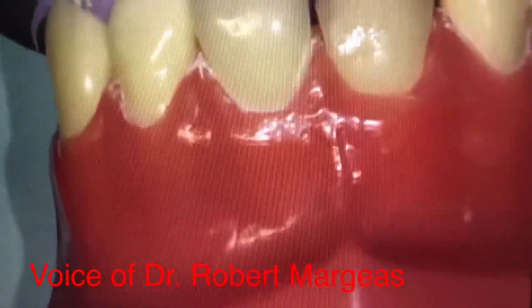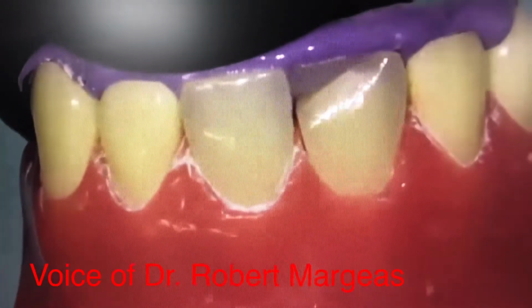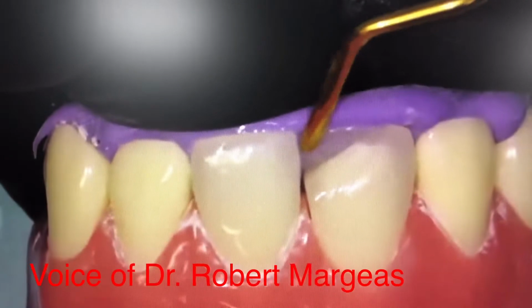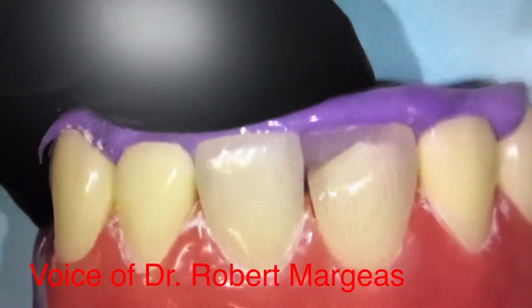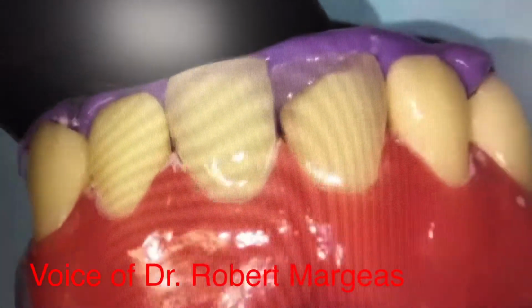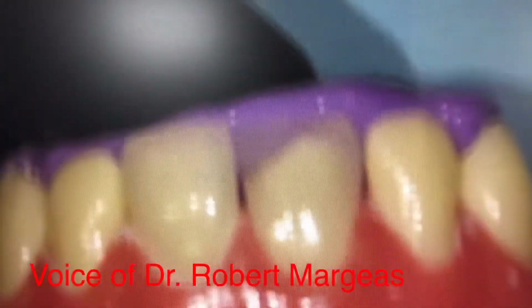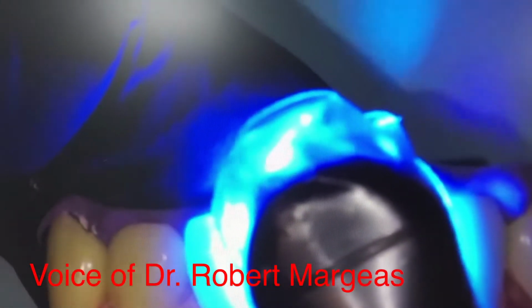And what I want to do is place that there, and then go ahead and thin it out. You'll notice here the key is that it does not go onto the facial. It does not go onto the facial. It's only capturing that lingual. Okay? And then I'm going to light cure it. All this is a rampart for my next layer.